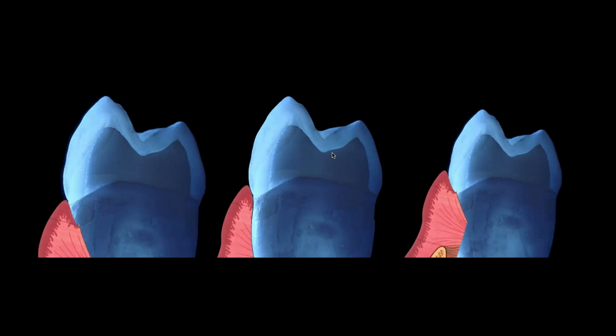And then the last aspect of this is, I said that marginal placement can really be dependent on the depth of margin, my prep in 2/10, 3/10, 4/10, and how low or equal am I placing that margin. And for me, that's all about the tissue type. When you're in bio 1, very thin tissue, I want you to speak to your doctors in a way that you keep your margin right at that gingival line, not usually more than 2, 3, 4 tenths of a millimeter below.